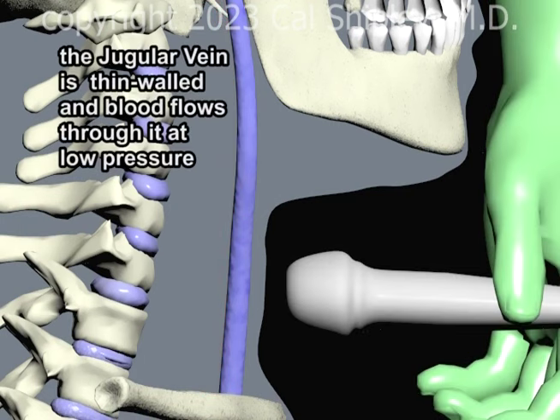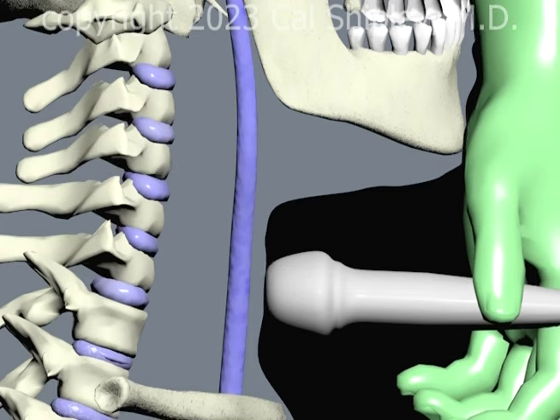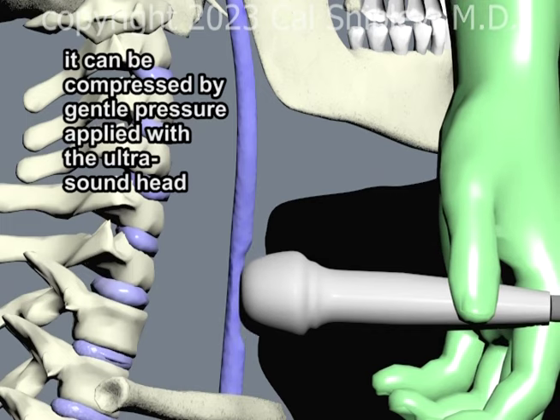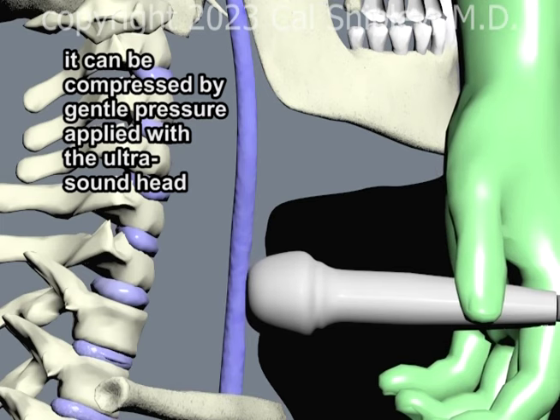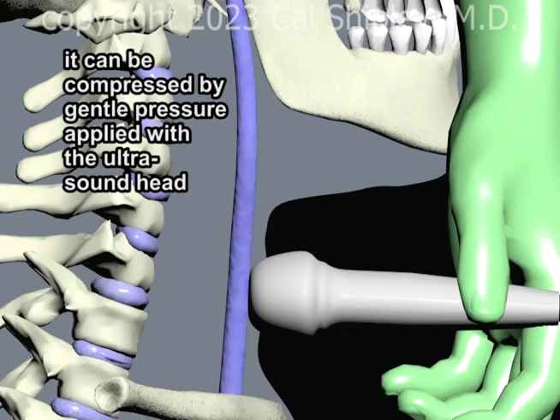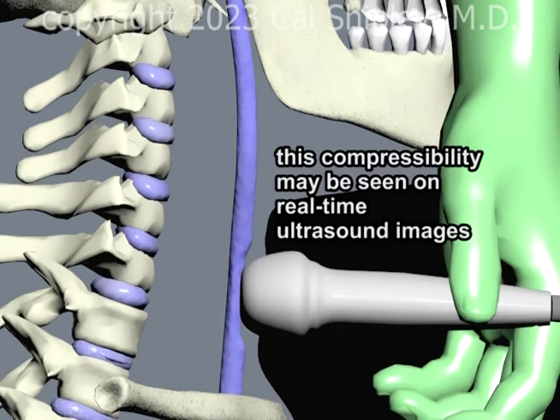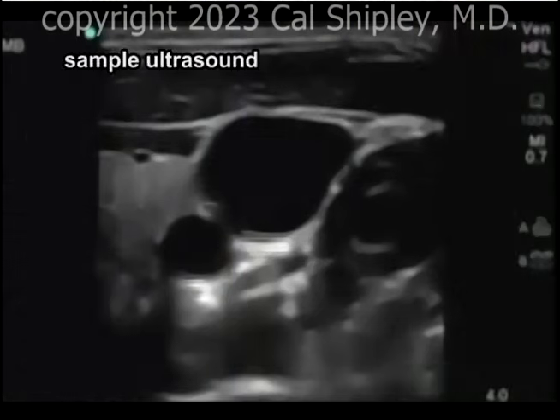Relative to the carotid artery, the internal jugular vein is a thin-walled structure, and blood flows through it at low pressures. It can be compressed by gentle pressure applied with the ultrasound head. This compressibility may be seen on real-time ultrasound imaging. Here is a sample of actual real-time ultrasound imaging demonstrating this phenomenon.